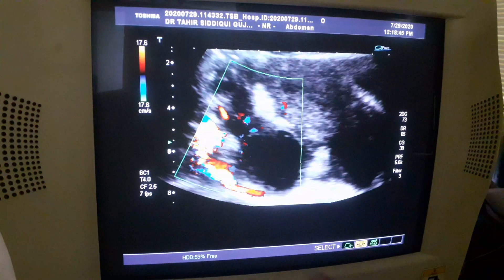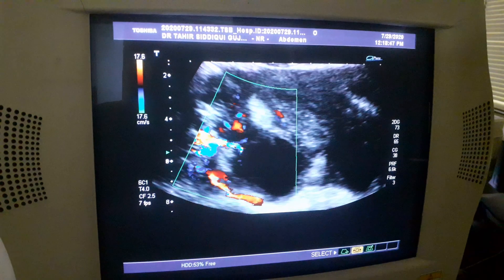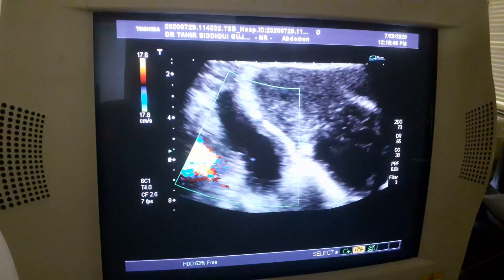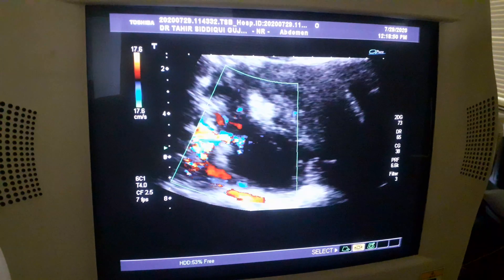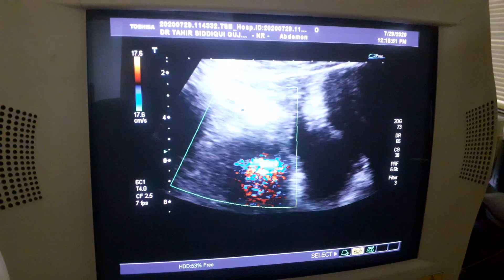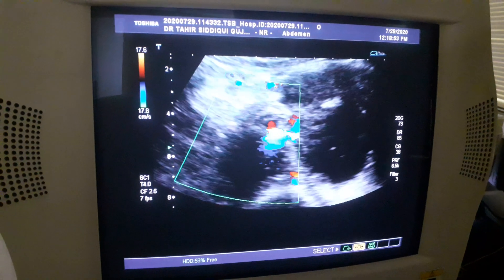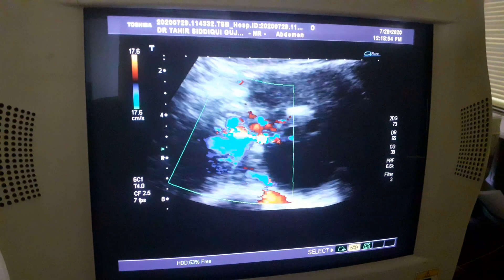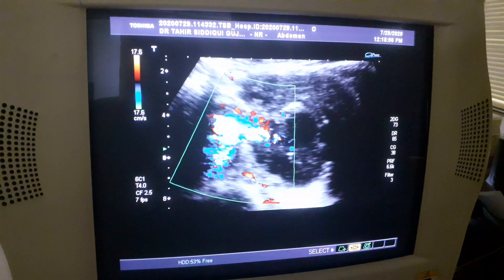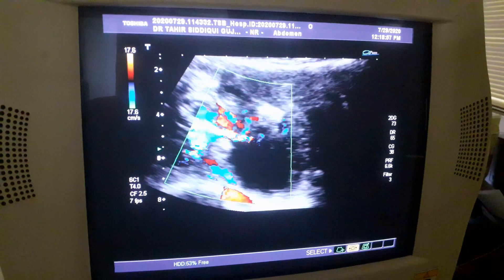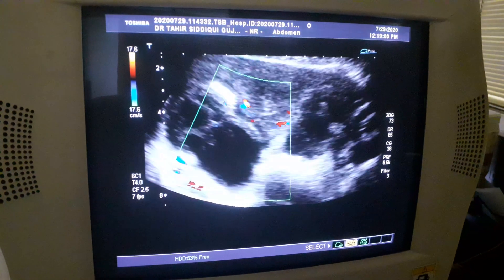You are seeing the ovarian and iliac vessels up here — iliac vessels. This is the right side landmark for the identification of the ovarian.